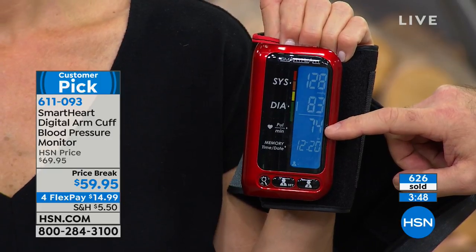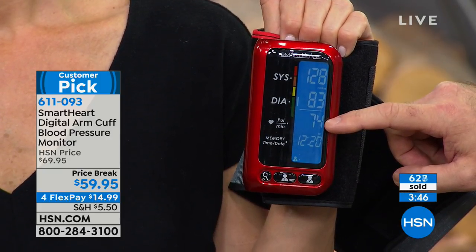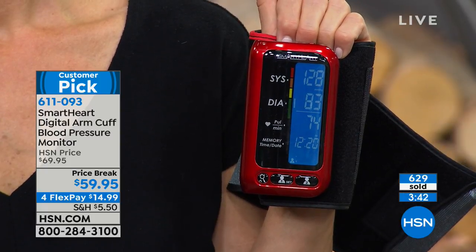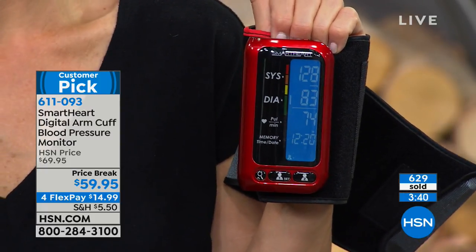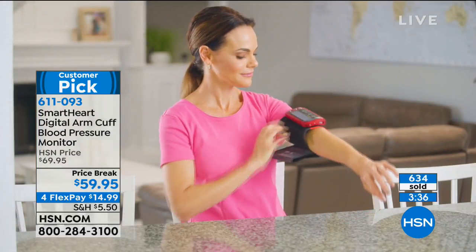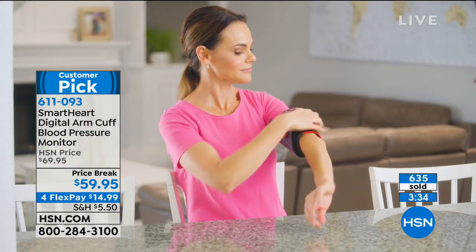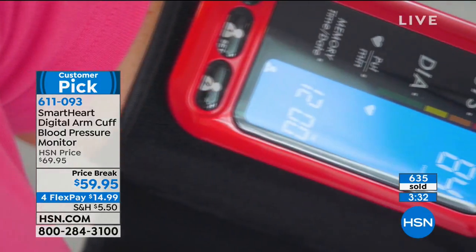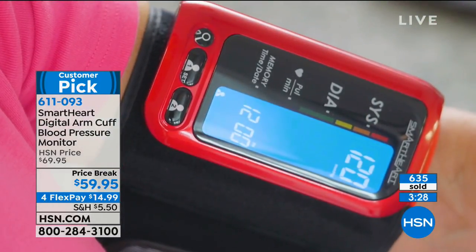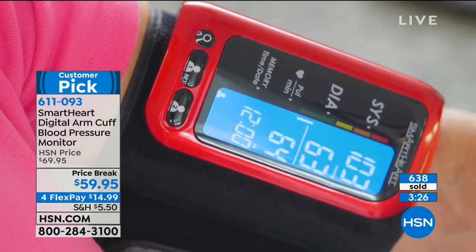She had an 81 before for a pulse and it's 74 for her heart rate now. Again, time and date stamped. Jennifer is looking more and more comfortable and relaxed as her readings level out. It's all about peace of mind. And this comes with a five-year warranty. It is also a perfect five-star customer pick.